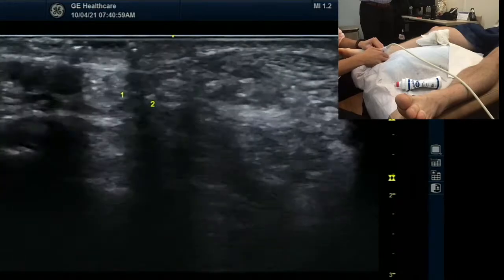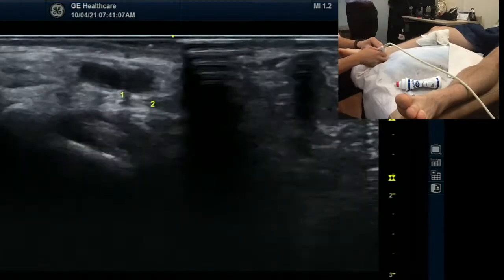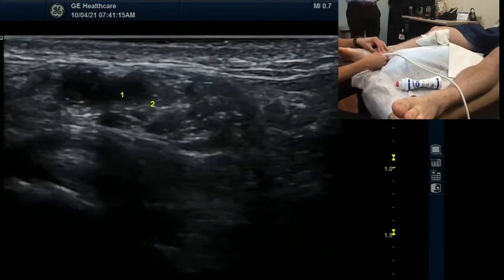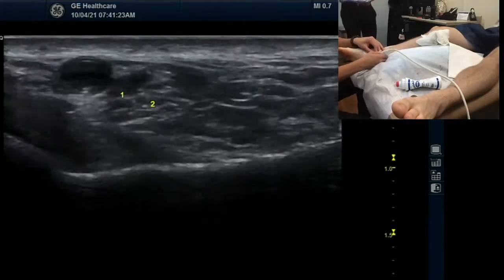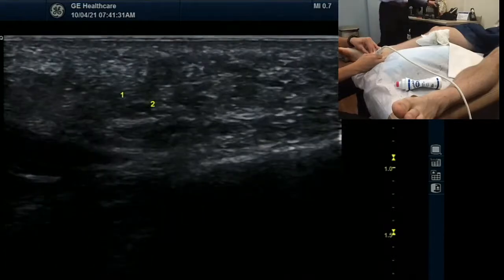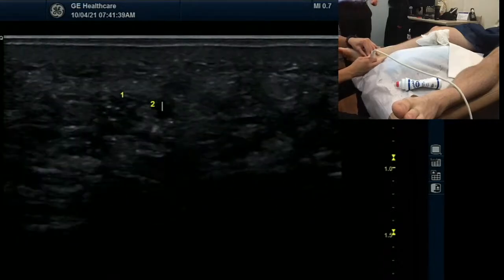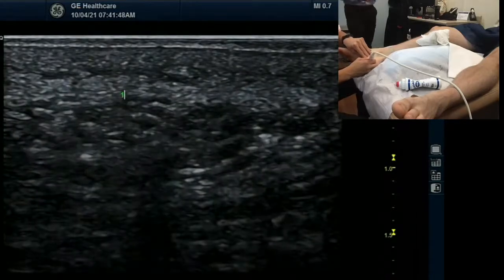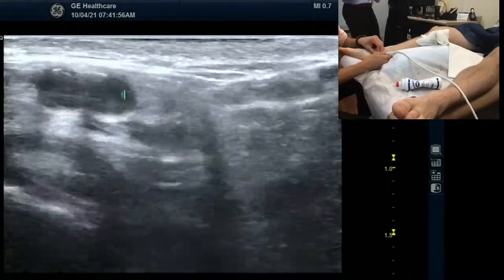Can we use a smaller probe to better delineate the divisions? We're never going to get to the bottom of the foot. We have progressed further down the leg today. It takes so long — mark our progress. We have dedicated all September to the tibial nerve. It's officially tibial nerve September from now on. We'll make a t-shirt out of it. It's fun. Nobody's really doing that much — this is where it can be pioneering. I think that might be the medial calcaneal nerve, because I'm right over his calcaneus.